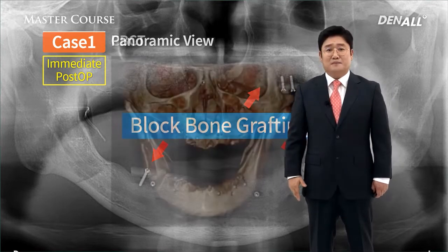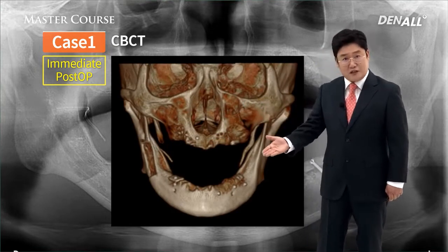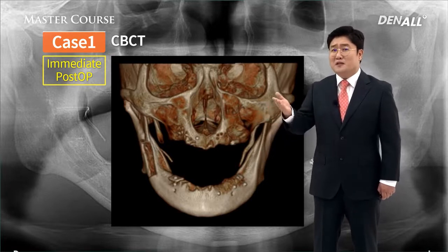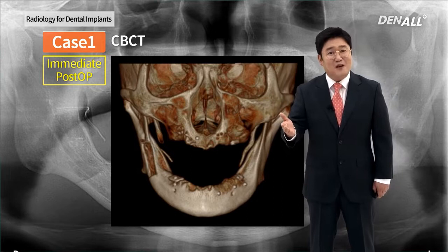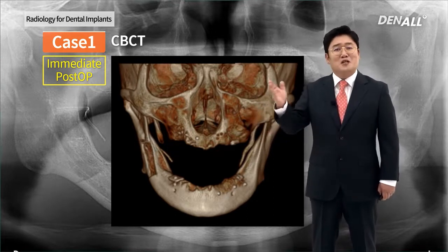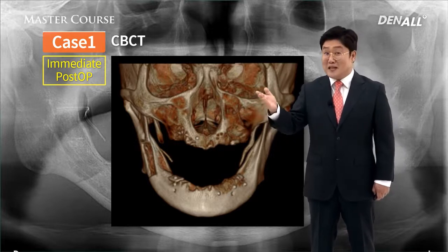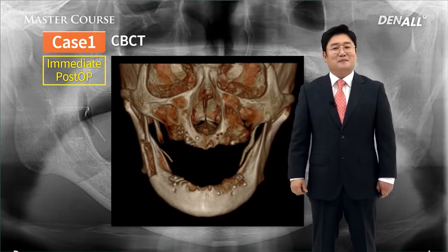The treatment outcome can be checked with CBCT as well. In the past, Panorama had limitations in predicting the treatment outcome or complications. Using the CBCT, the issue was addressed and accurate evaluations can be done with the CBCT. Advancement of CBCT pushed the advancement of implantology as well.